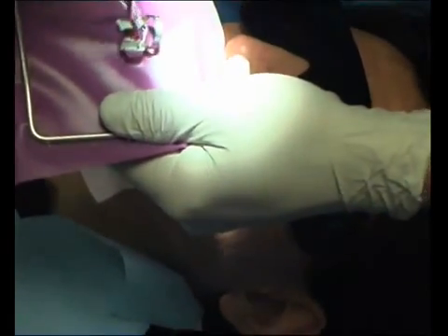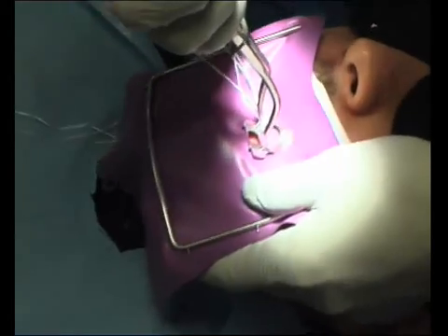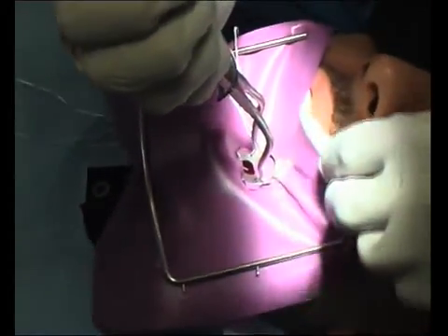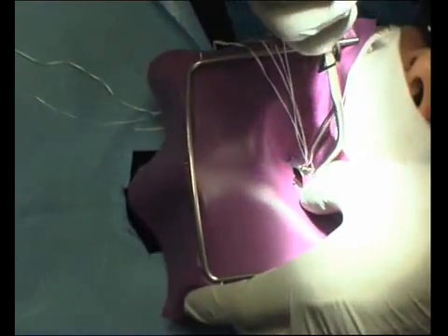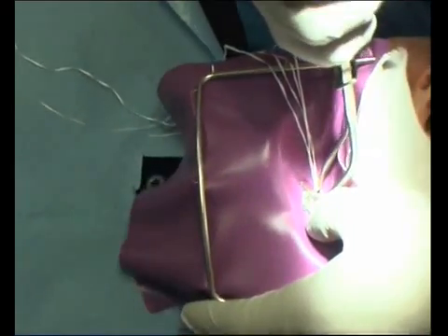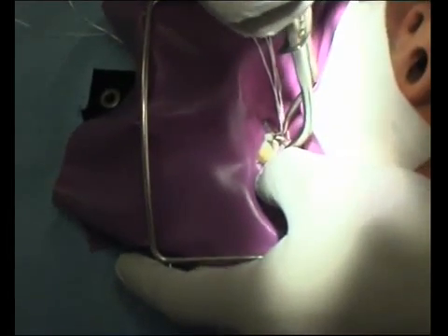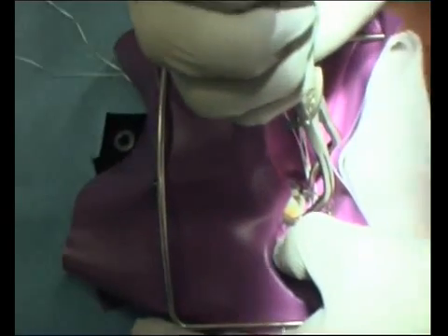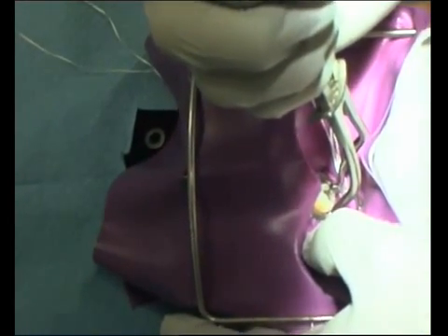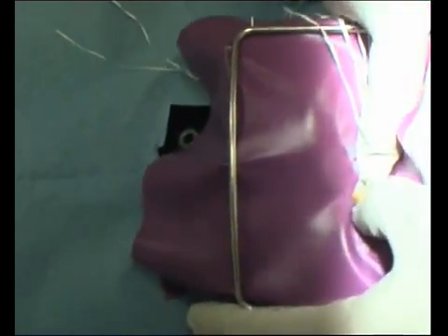So now we're going to pull — nice and wide, please. Just going to place that over the tooth. Make sure it's far down enough so it engages into the bulbosity, and then just gently release. Is that okay? It's nice and firm.